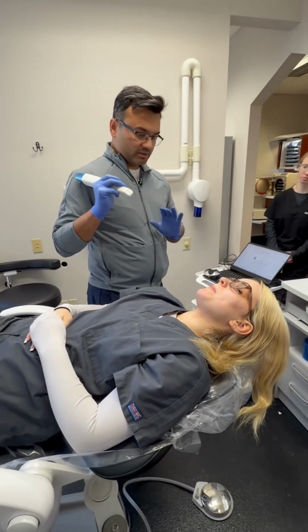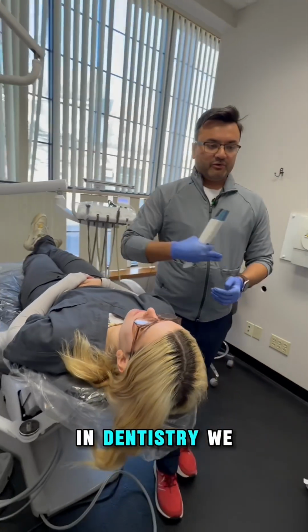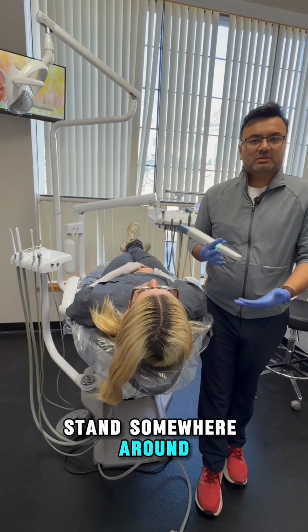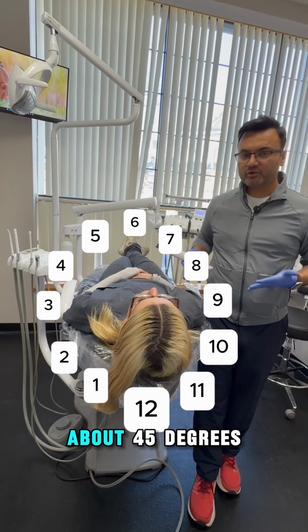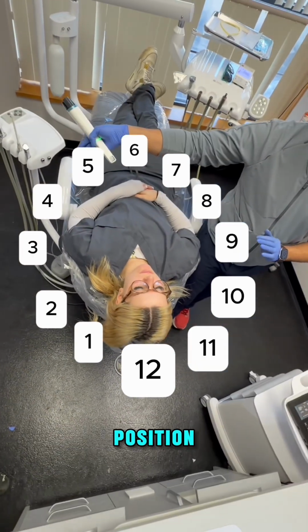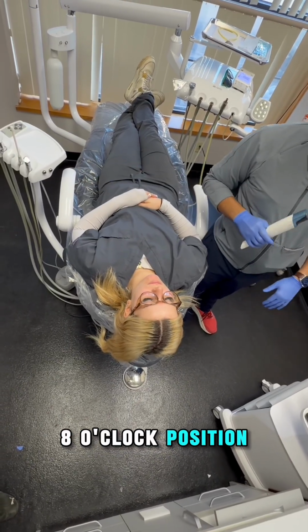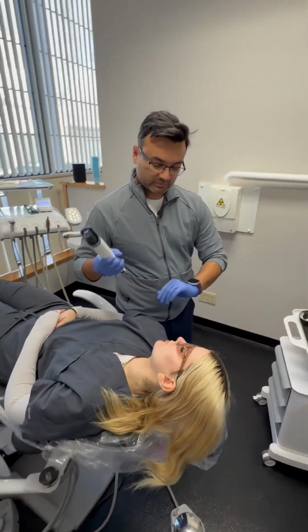Now again, how do we really start a maxillary scan? We all know in dentistry we use clock positions. So I always stand somewhere around 7, 8 position so that I'm about 45 degrees this way. If you're left-handed, you're going to stand around the same position, what we call 4 or 5 o'clock position. This is 7, 8 o'clock position. Have the patient turn towards me. Turn a little bit towards me, please.